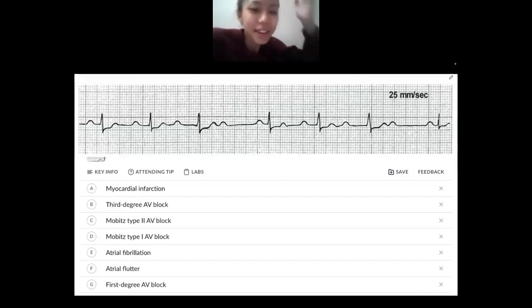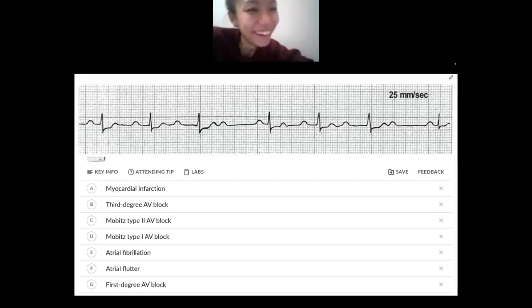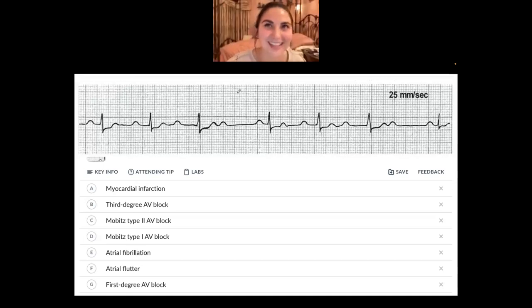Christina, I just want to say that I'm still very blown away by the ischemia. The transmural ischemia. I don't know why, but that was cool. Because it's not like an ST elevation, it's technically like everything else is just lower. It's like it's lying to you. Yeah, still thinking about it. I'm literally so glad you're so happy, because I was so happy when I learned that. I was like, that's so cool.